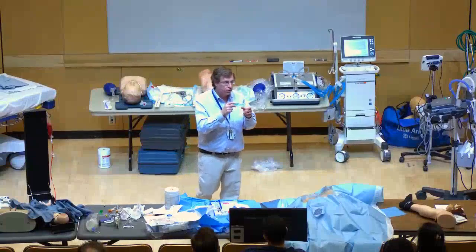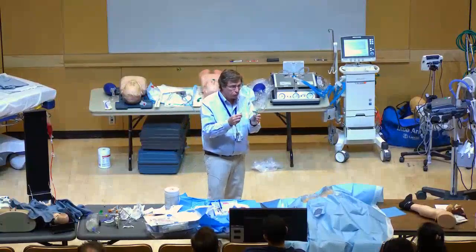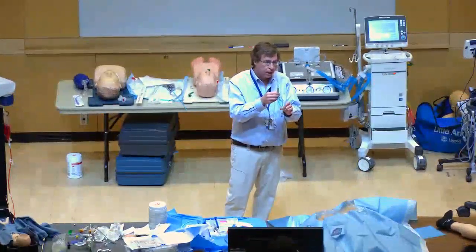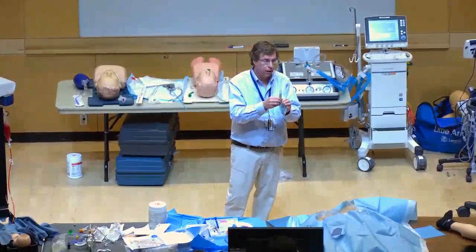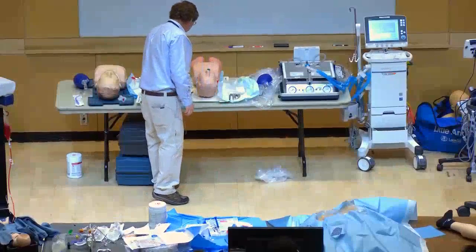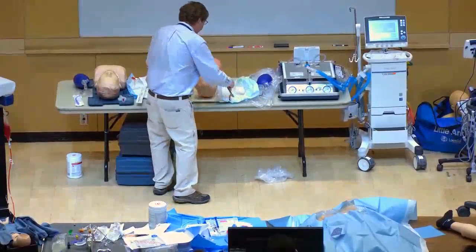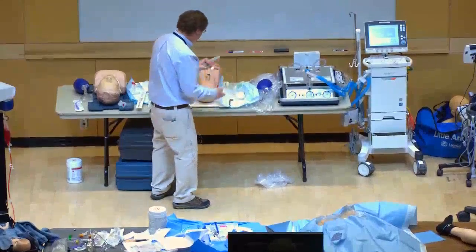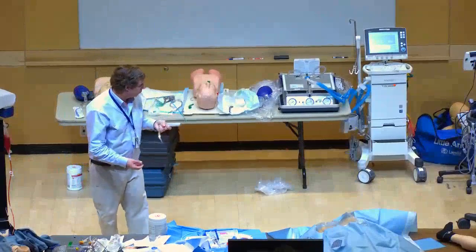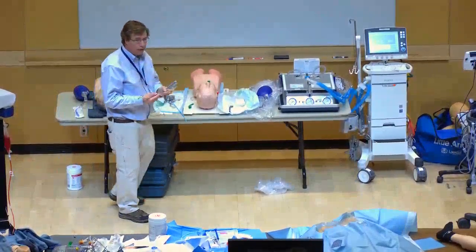Sometimes you have to advance a little more. Honestly, intubating the dummy is harder than a real person because nothing here is lubricated — in a real situation it just slips right through the cords.